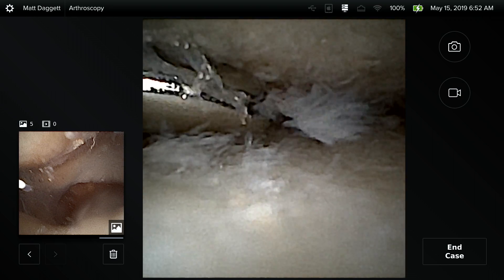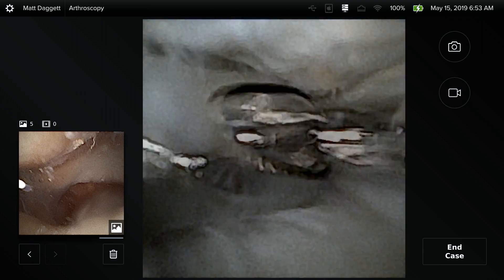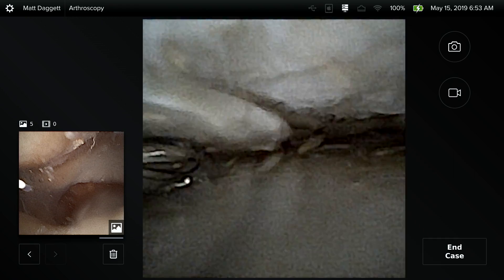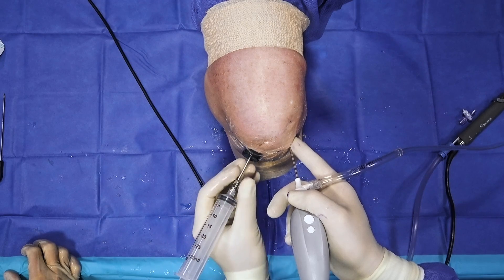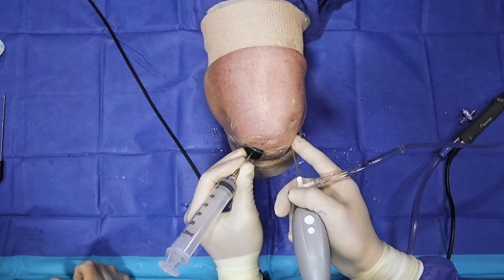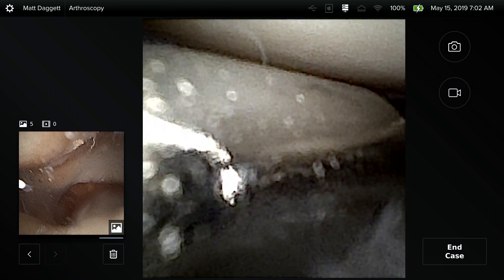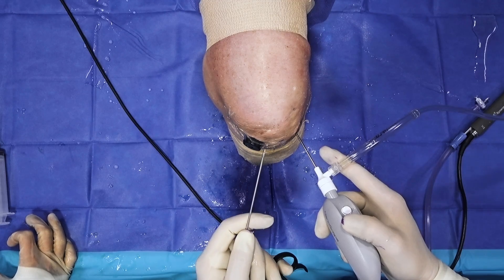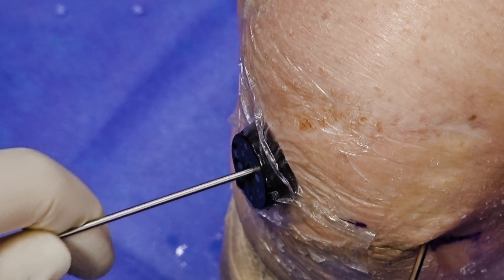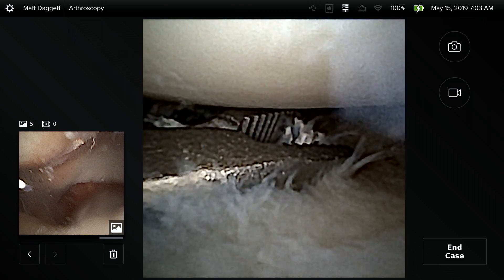The two millimeter nano arthroscopy shaver really allows us to access these hard to reach areas atraumatically. This technology allows us to treat some of these common orthopedic conditions in a very minimally invasive manner. You can utilize two different methods of removing arthroscopic debris: either the arthroscopic shaver or the 2.4 millimeter outflow cannula, which can be attached to either a syringe or suction tubing. This is also a good way to drain the knee at the culmination of the procedure. Another instrument is the nano grasper, which allows us to grasp loose bodies or debris for removal, all going through the same cannula set up initially. Here we grab a loose body of cartilage debris floating within the knee.